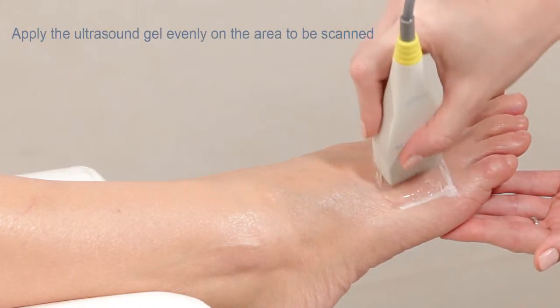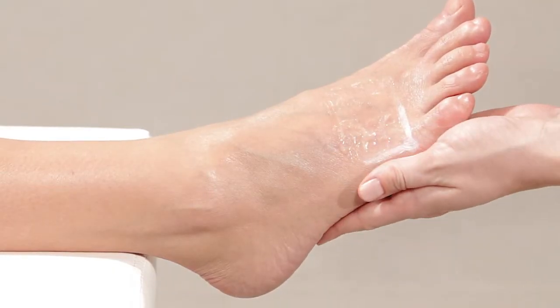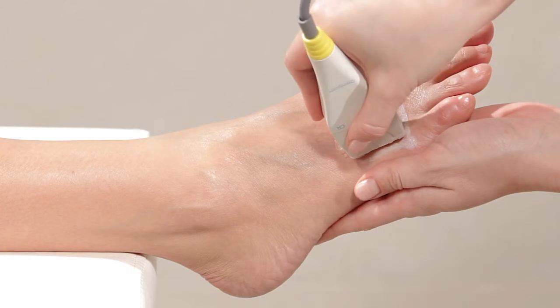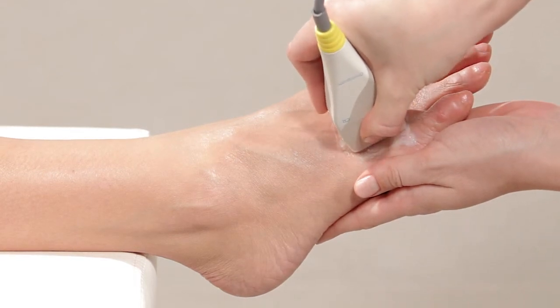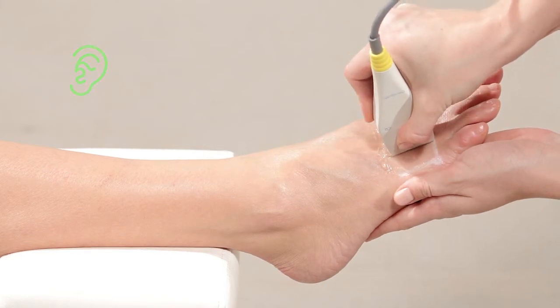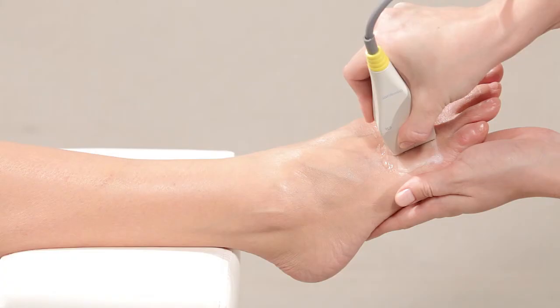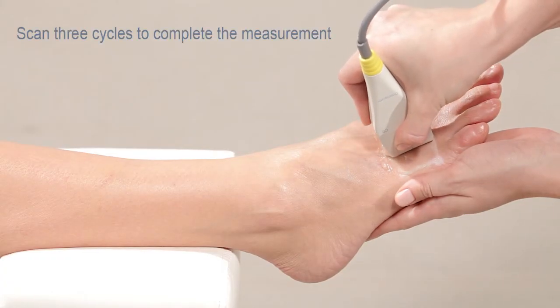You are now ready to begin measurement. Press start. Begin scanning the flat surface of the bone by moving the probe back and forth one to two centimeters in each direction. A beeping sound confirms that you are measuring correctly. Each scanning cycle should take about 20 seconds. Scan three cycles to complete the measurement.